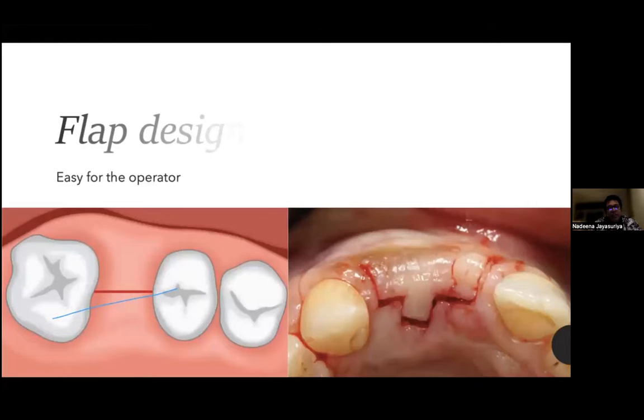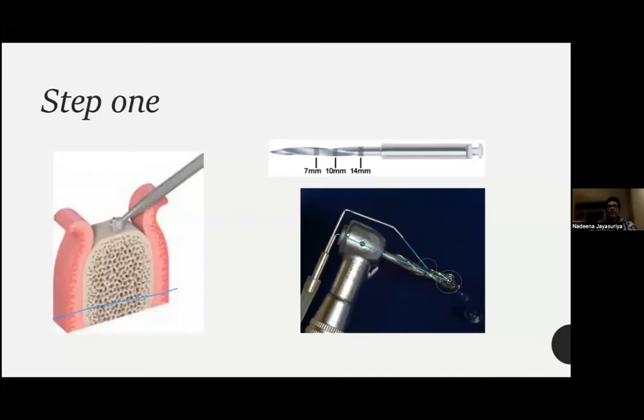Is a bone. Traditionally, we the two teeth, but now it's very much easy if you cut the incision to one side. You hold the flap on with your retractor, and you get good access to the bone ridge. If you make the cut in the middle, you'll have to retract both the sides. So that's going to be a bit difficult.